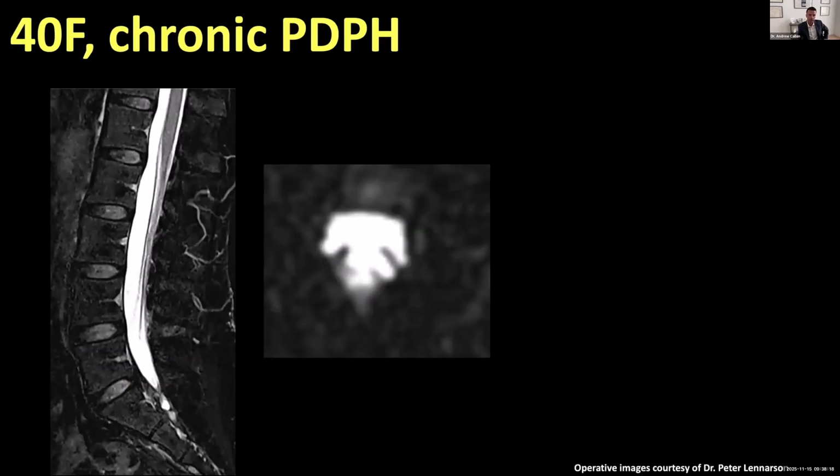And Dr. Beck described this very nicely in the preceding talk. But I just want to show one example of a patient in whom we saw this quite profoundly. So this is a patient who was 40 years old, had chronic post-dural puncture headache.